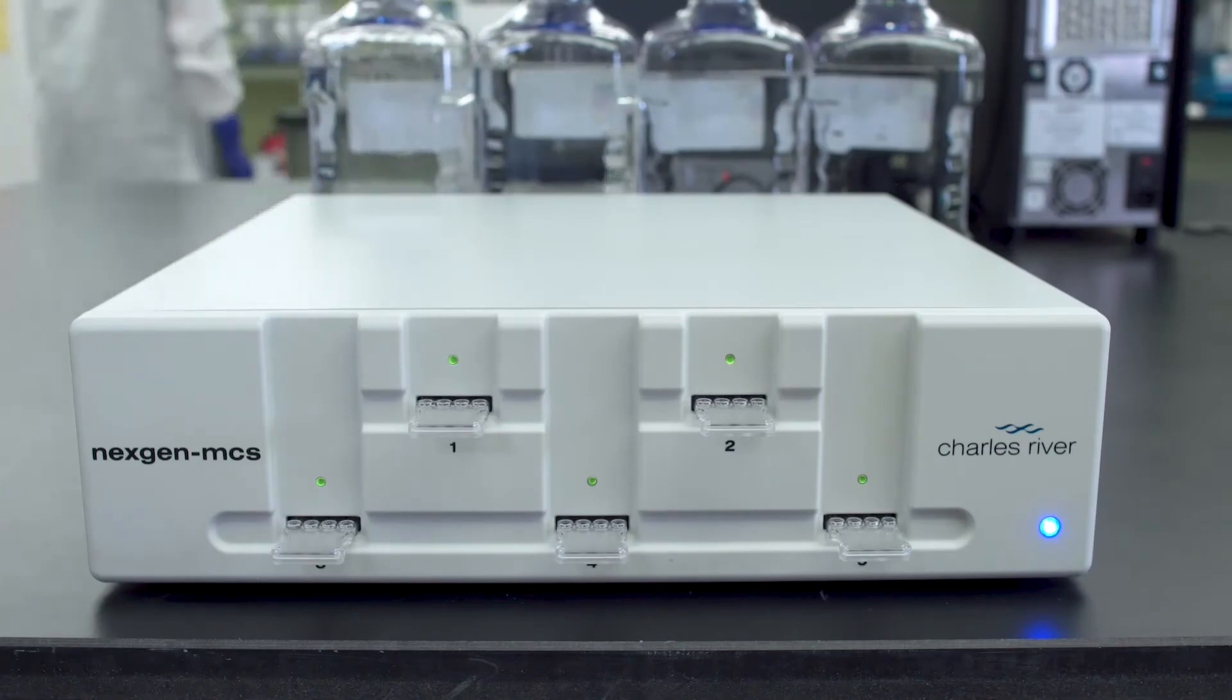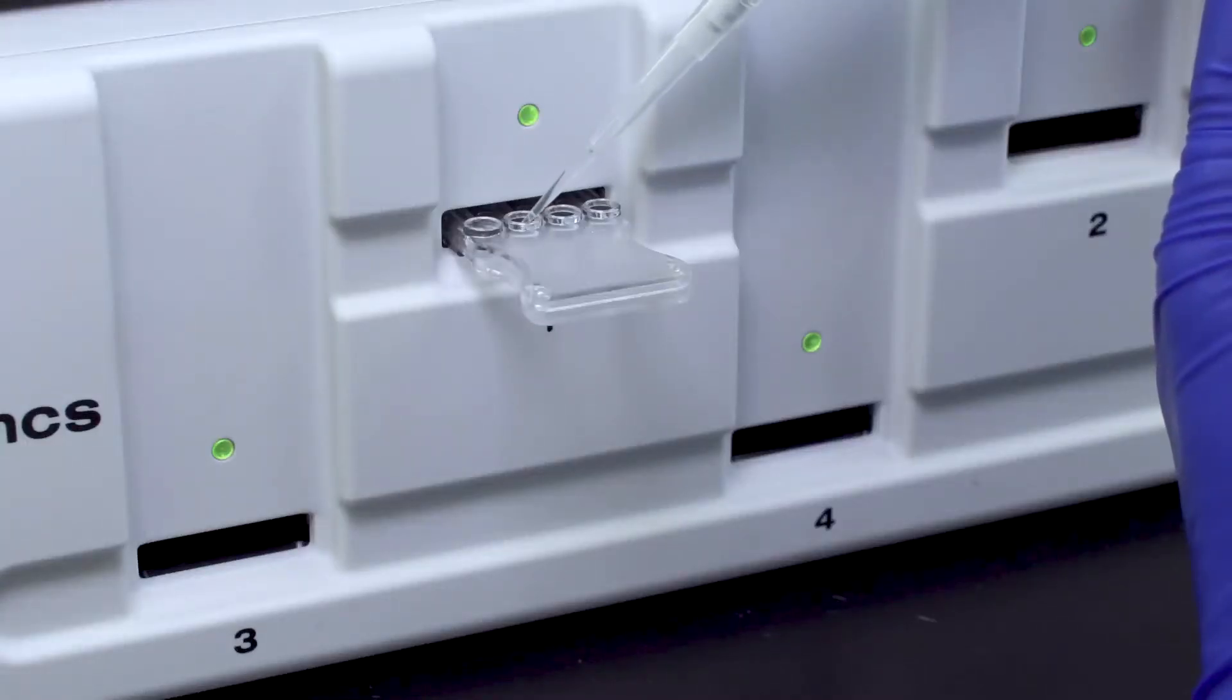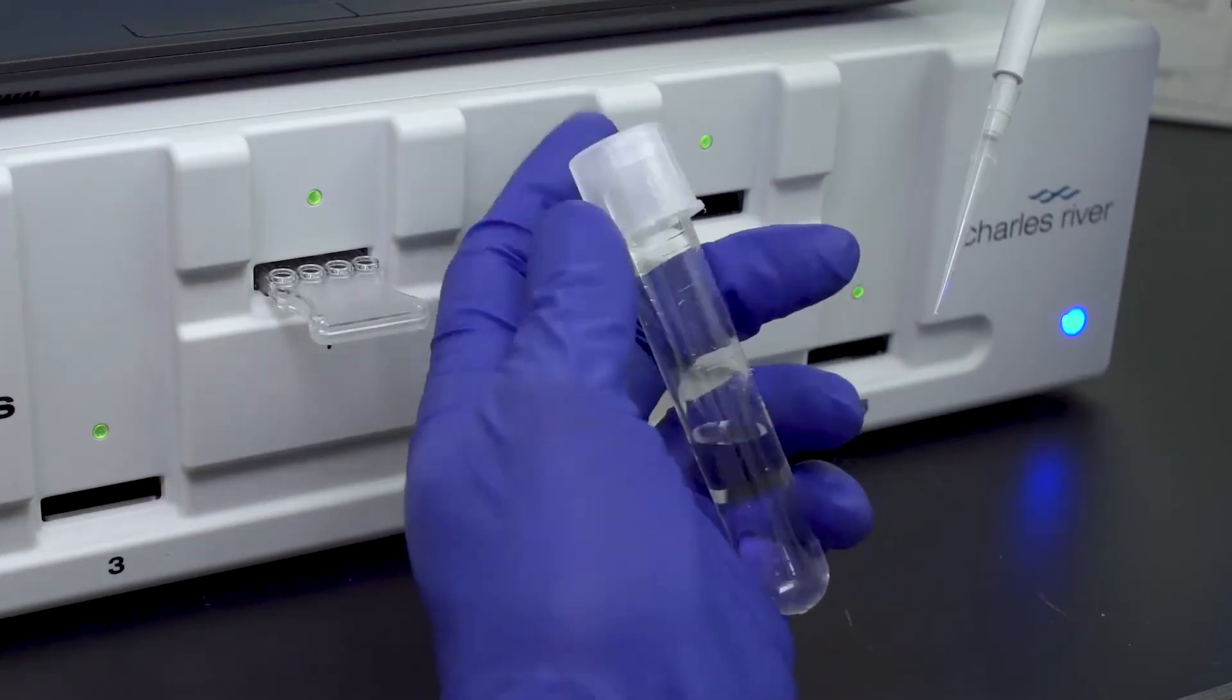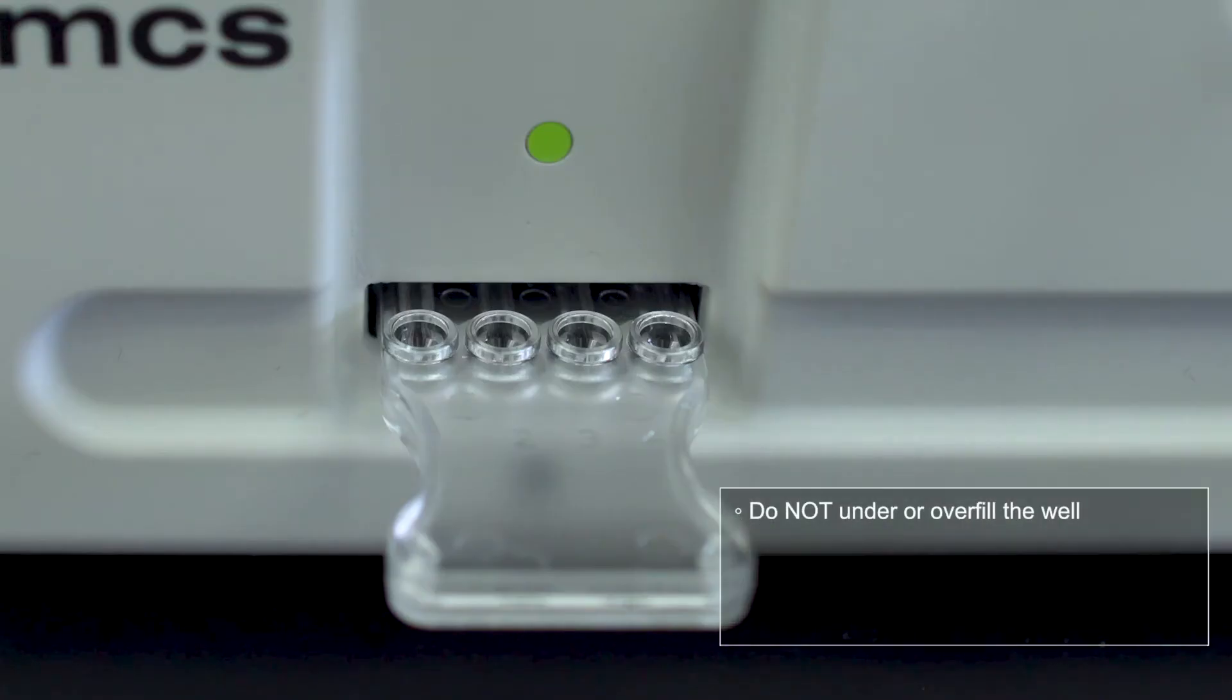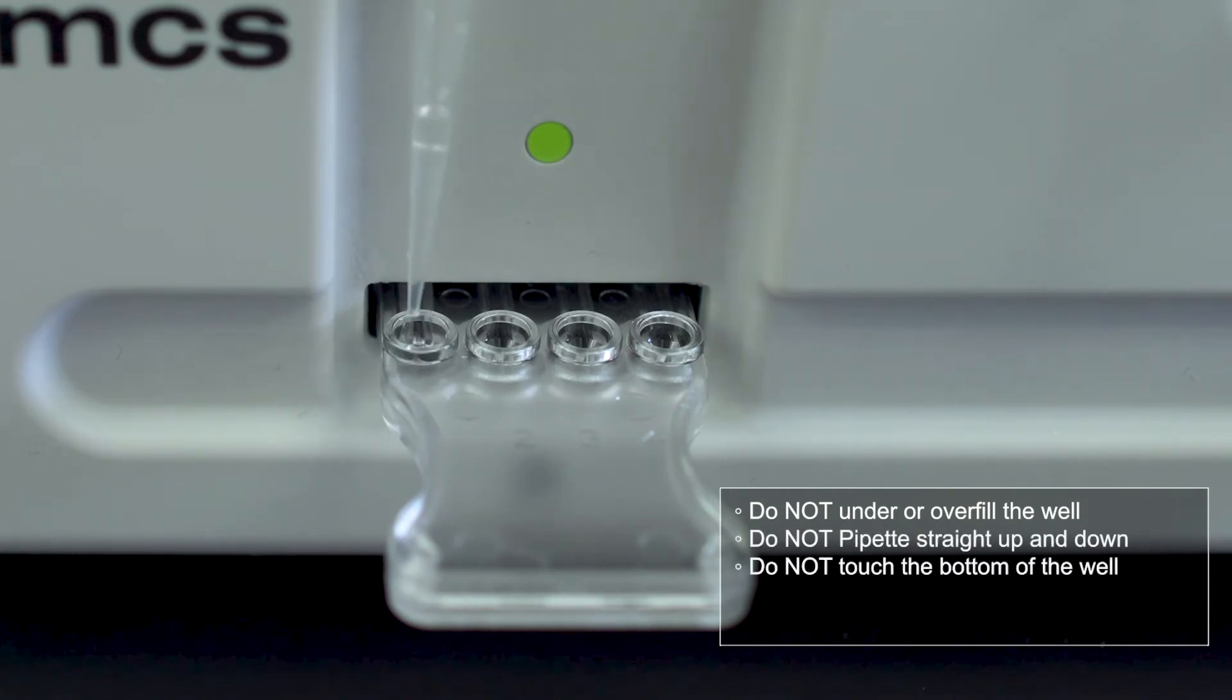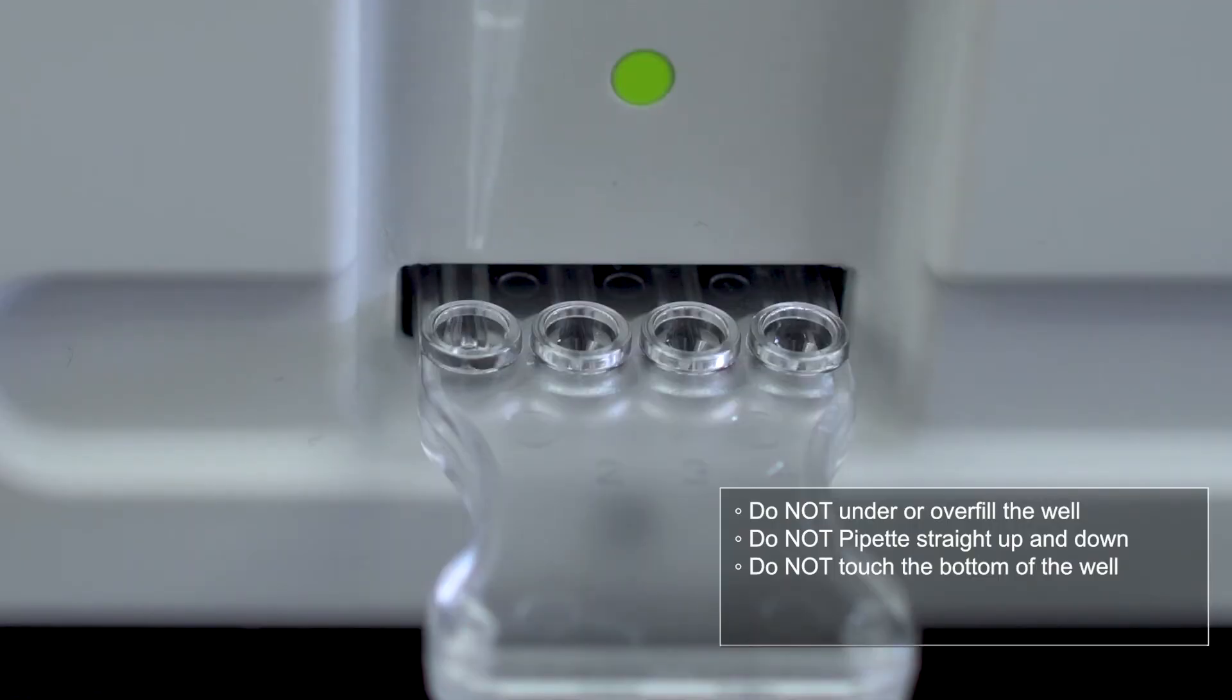For reliable results, it is important that you pipette the sample correctly. You need exactly 25 micro-liters of sample before the test is started. Do not under or overfill the well and do not pipette straight up and down, touching the bottom of the well. Also, be careful not to create bubbles when adding the sample.